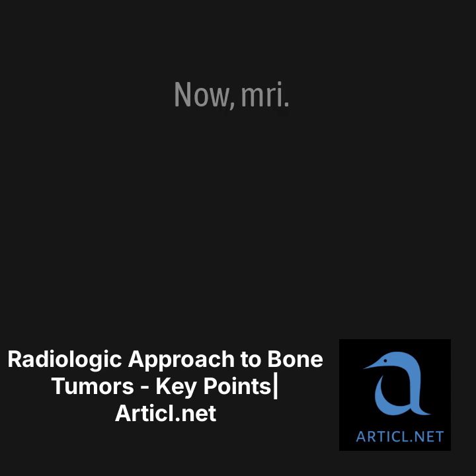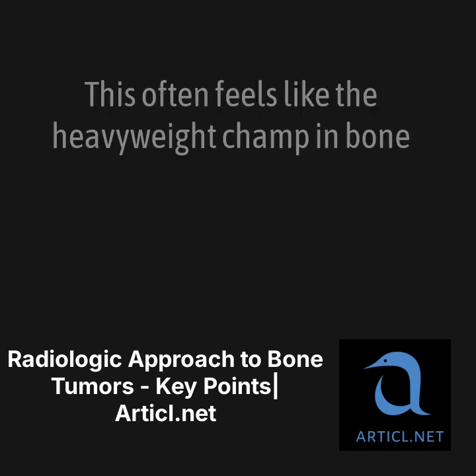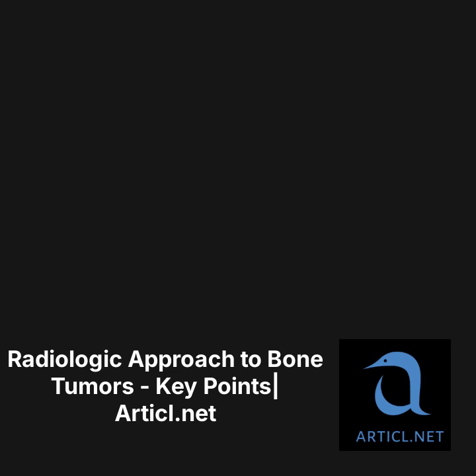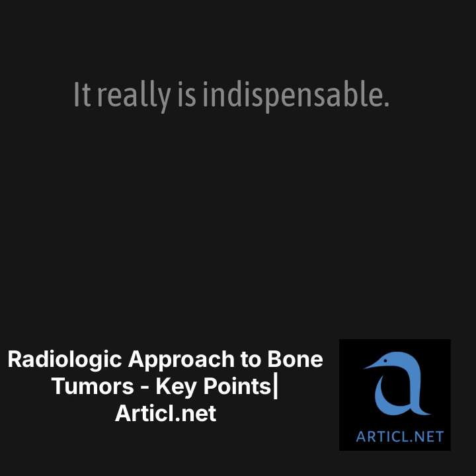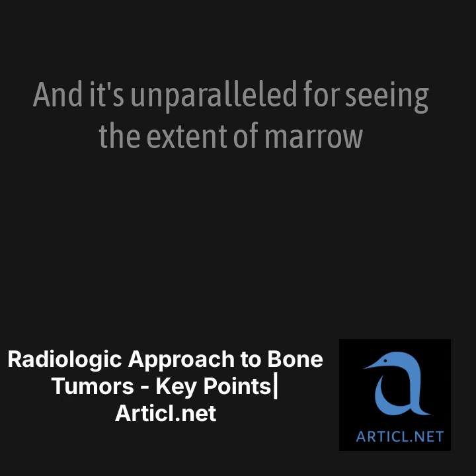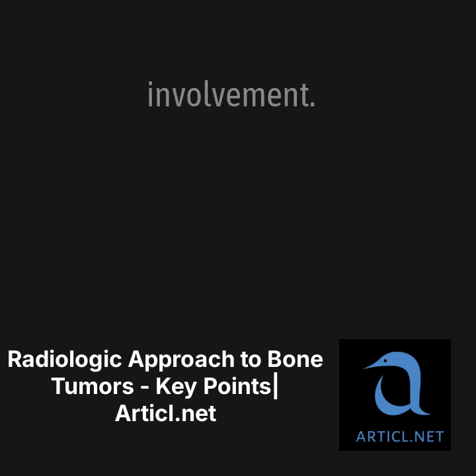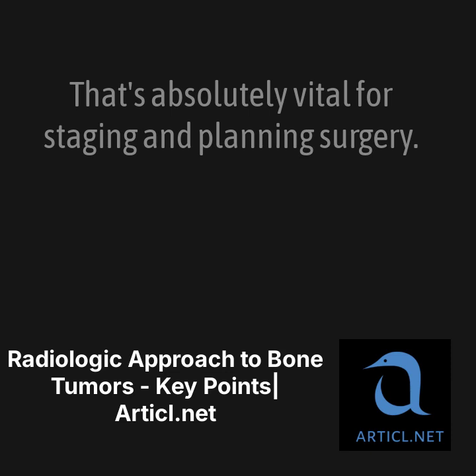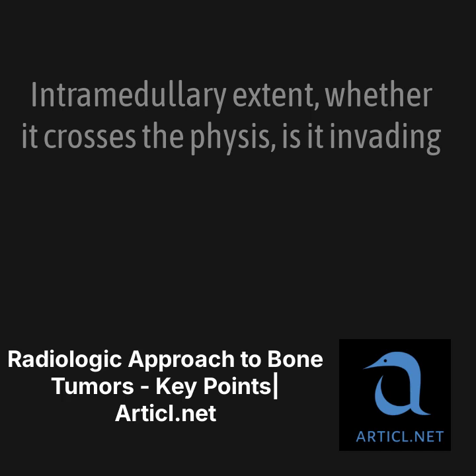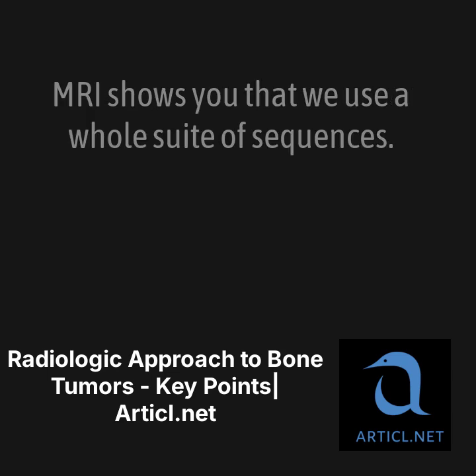Okay, now, MRI. This often feels like the heavyweight champ in bone tumor imaging, especially for marrow and soft tissues. It really is indispensable. The soft tissue contrast is just phenomenal, and it's unparalleled for seeing the extent of marrow involvement. That's absolutely vital for staging and planning surgery. Knowing exactly how far it goes. Yeah, intramedullary extent, whether it crosses the physis, is it invading nerves or vessels nearby? MRI shows you that. We use a whole suite of sequences.